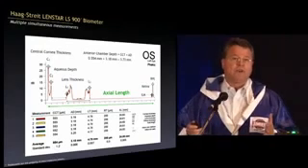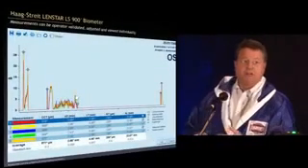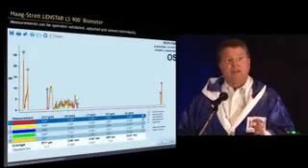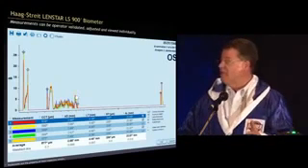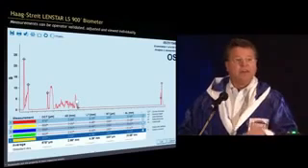You can move the calipers wherever you want. If a little spike comes up where it's not supposed to be, you can go ahead and correct it. So here's a measurement where the operator has actually taken the electronic caliper and put it on the posterior capsule. And you can even look at individual measurements and sort those out, delete, repeat, pretty much do whatever you want.